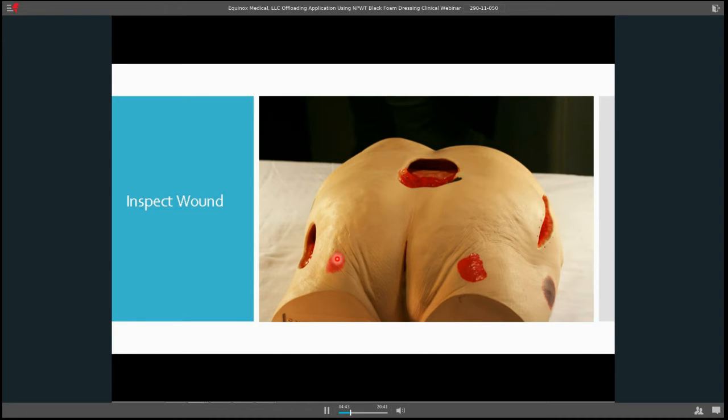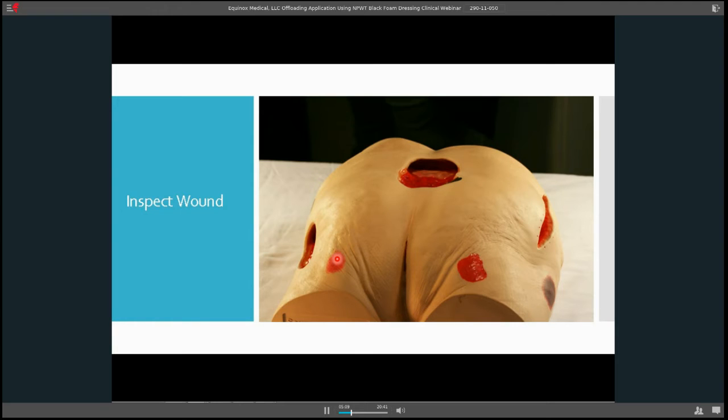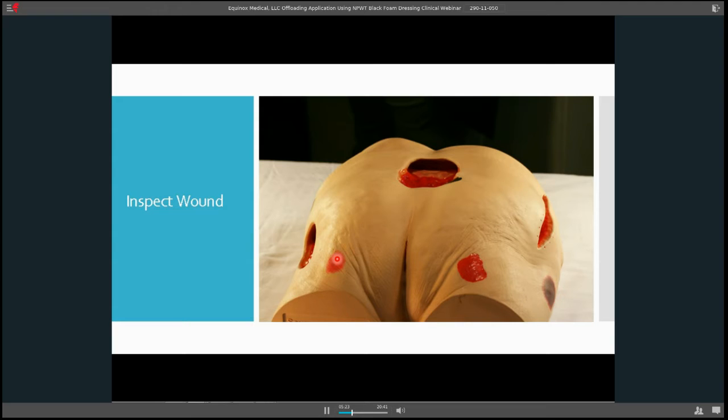Inspecting the wound is the first thing. You want to assess the wound and determine if it's even appropriate for negative pressure. You're going to assess the wound with every single dressing change. It's important for any salespeople, every single wound is different. At no time can we actually say that wound can use it. There are many things that need to be determined before the actual decision is made for negative pressure. That's through a doctor's order as well. The nurses should be assessing to see if it really is appropriate, or if there's anything that might hold it off and delay it for a while before it's able to be started.